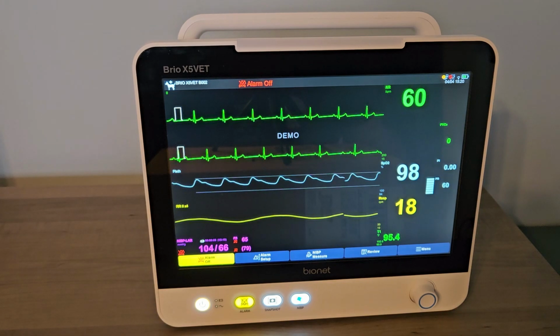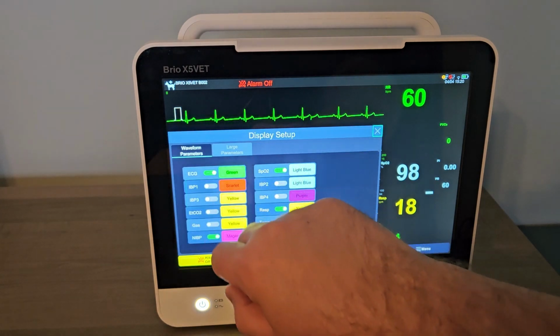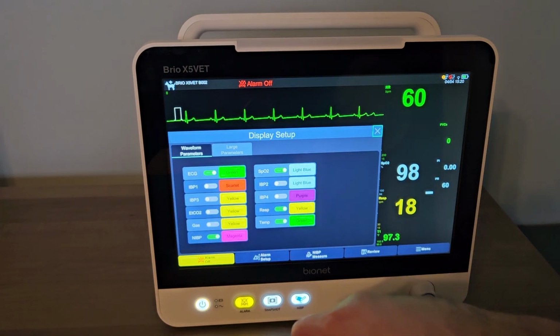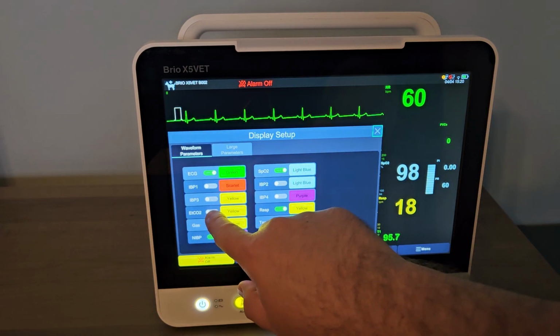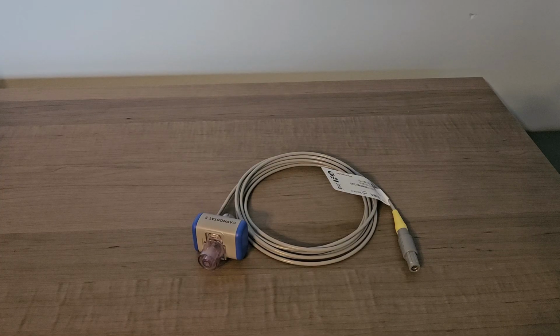To do this, tap the menu button at the bottom of the screen, and then select Display Setup. In this window, ensure that the EtCO2 parameter has a green box next to the toggle to turn on the parameter. The following section covers mainstream EtCO2. For instructions on sidestream EtCO2, please contact service for any questions.